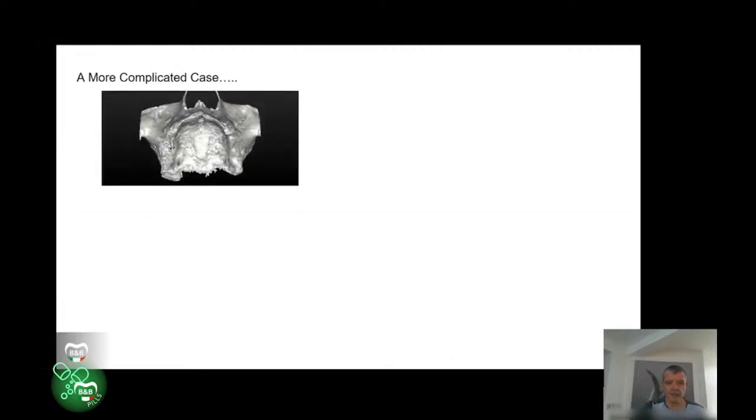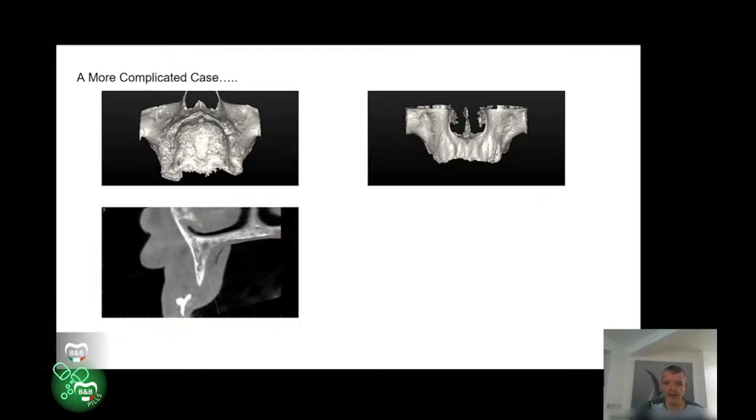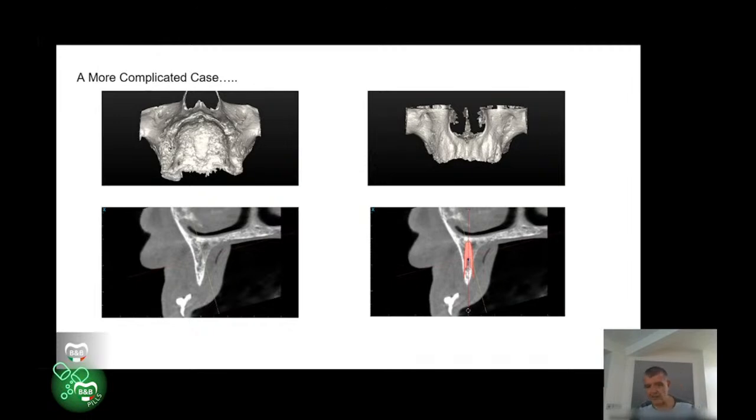If we look at this lady here, she has a pretty atrophic maxilla, almost a knife edge ridge there. We were scratching around trying to position 4 implants for her because she was desperate to have a fixed prosthesis. In the one area, I think it was in this left lateral, where we were trying to get an implant somewhere around here, this is what we were faced with, this sort of knife edge ridge of the bone there. And when we did the planning for the implant, this is the narrowest of the B&B implants. This is the 3.5 diameter implant.